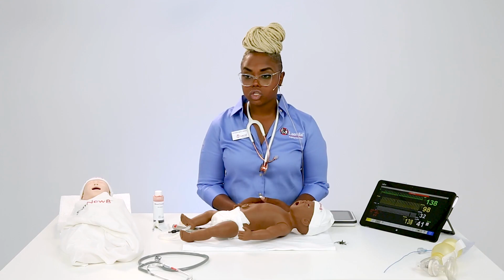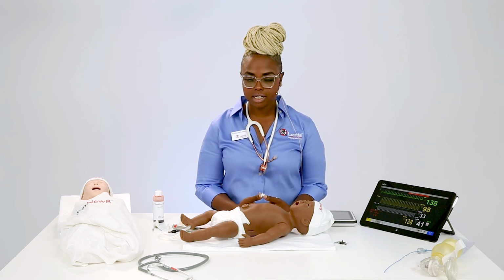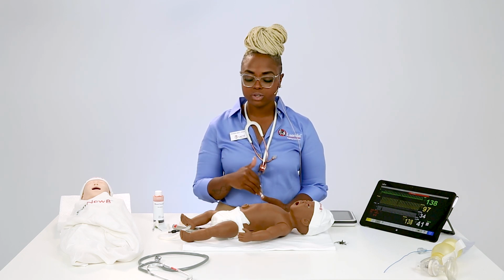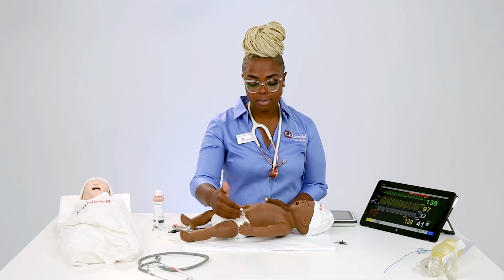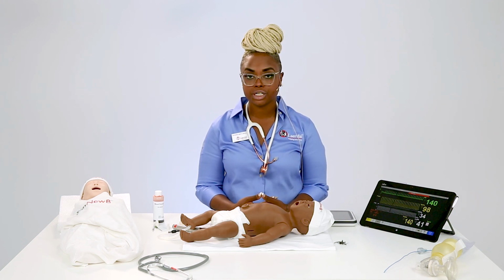Thanks, Rotera. How much fluid can be given via the umbilical? So honestly, it's an open system. As far as the blood component, it's going to be about an ml of blood, because when you're utilizing the umbilicus in real life, it's not going to be a whole lot of volume. But as far as high rate infusions, because it's an open system again, you'd be able to run fluids just like you would based upon the diameter and width of whatever catheter you're going to insert.